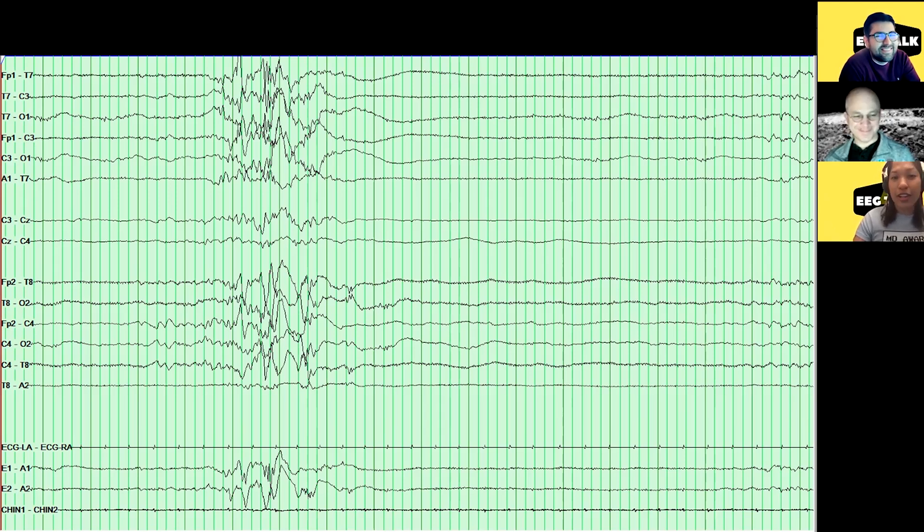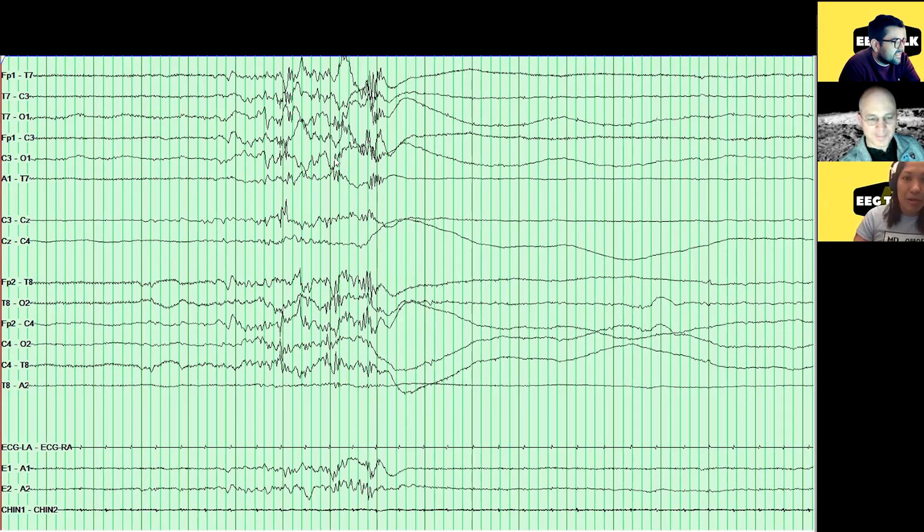That's the first difference you'll notice from your standard adult in a pentobarbital coma. So on the very first page, you see what looks like a burst, right? And then suppression. And for this baby's age range during sleep, this is normal. Wow. Maybe this is not quite the best example, but we have some delta. You have your black bars are one second with some superimposed beta on it, delta beta complexes, which are also normal for this baby's age range.